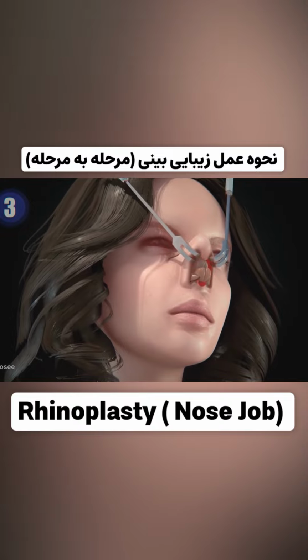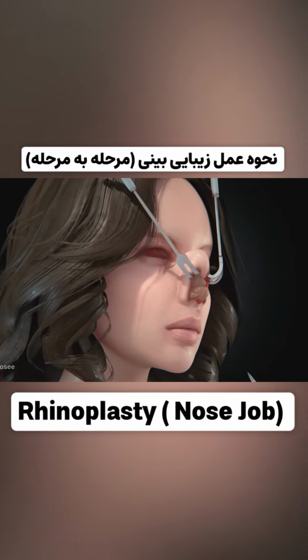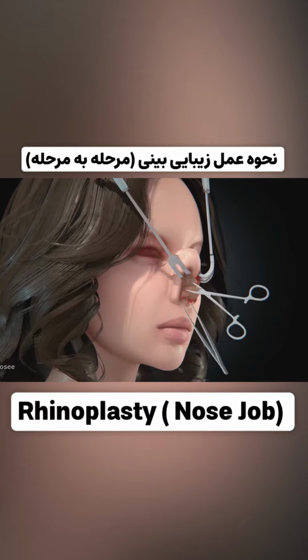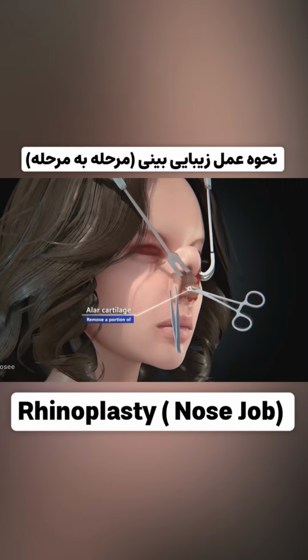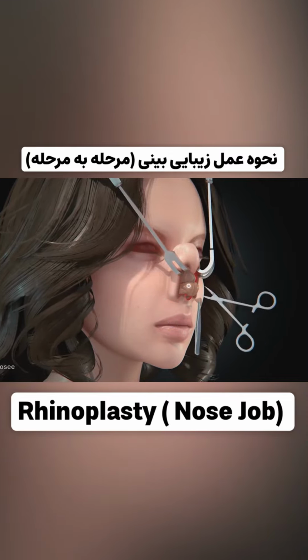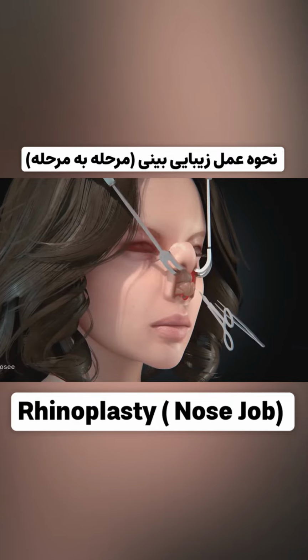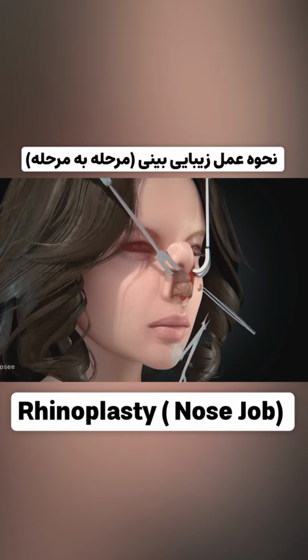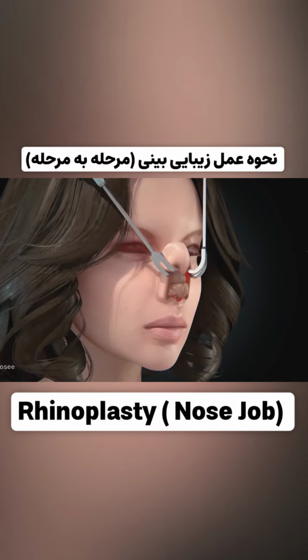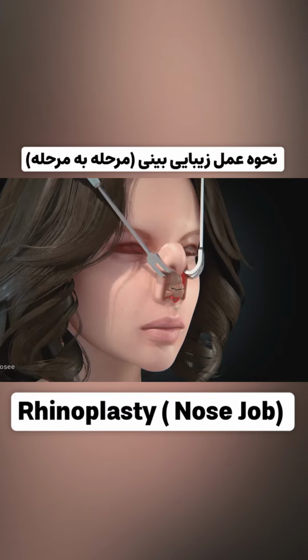Open rhinoplasty allows the doctor to better modify the nose in patients whose tip is wider or protruding. The specialist may choose to remove a portion of the alar cartilage, which is what helps define the cosmetic contour and nostrils. Likewise, the surgeon may choose to use sutures to direct or draw the alar cartilages inward in order to create a narrower tip or correct their position.